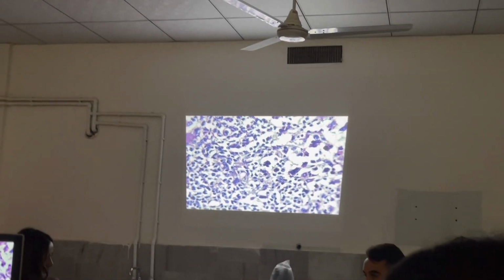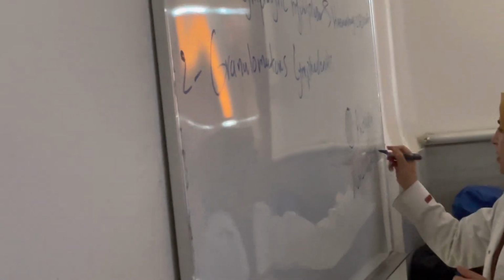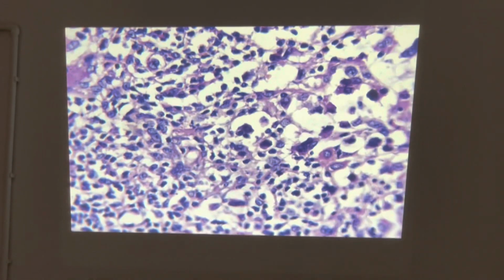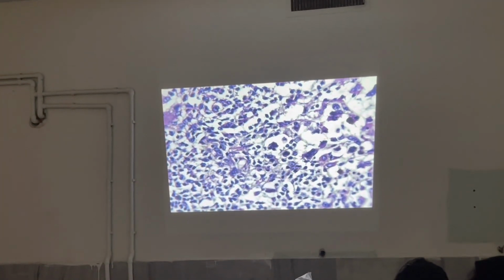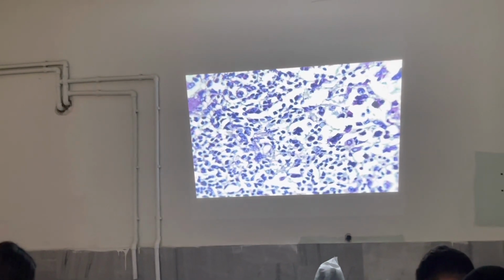Now let's see what it means by Hodgkin and non-Hodgkin. Hodgkin. This is pronounced Hodgkin. Hodgkin and non-Hodgkin. Tell me about that. How can you differentiate between Hodgkin and non-Hodgkin? In Hodgkin lymphoma, the proliferating lymphocytes have a special pattern or feature. It's called owl eye.